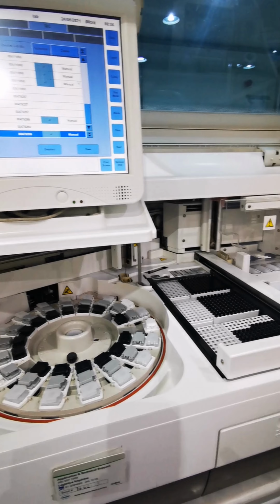How to do control in Cobas immunometry analyzer. Get your control from the refrigerator and allow it to stand at room temperature. Now you have to find the word QC in the monitor of our Cobas machine.